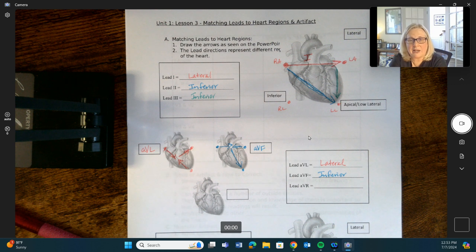We've got to take a look at it. If you only have 1, you have to have at least 2. If you only have 1, it's considered non-diagnostic. It doesn't mean that it means nothing. It just means that person's normal. It's a little bit different than other people, but it's not anything to be concerned about.